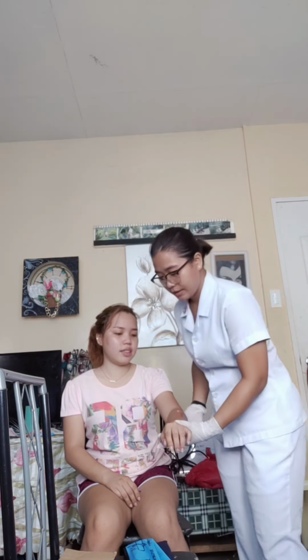Next, I am going to get the consent from our patient. Hello, ma'am. I am student nurse Esther Baguio, and I am trained to do first aid. May I, ma'am? Yes. Okay. It is necessary for us to get consent from our patient because patients have the right to make informed consent and decisions about their health care treatment.